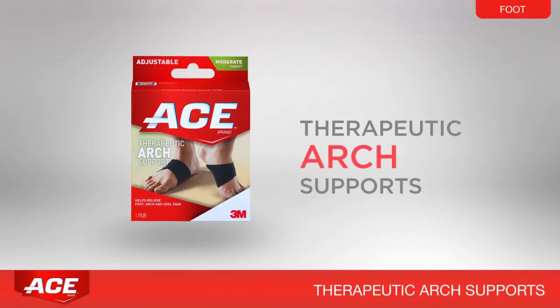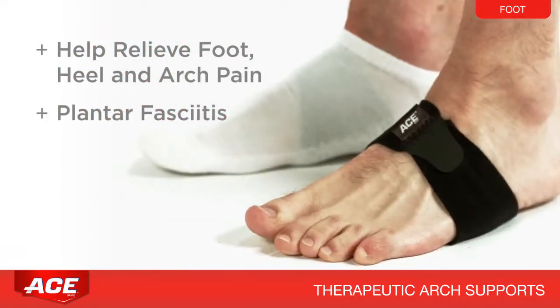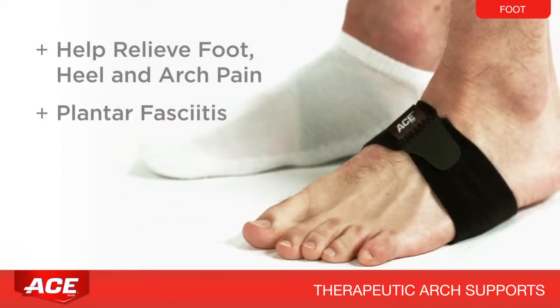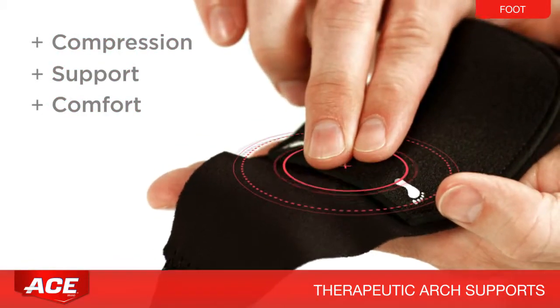Therapeutic arch supports help provide relief from foot, heel, or arch pain associated with plantar fasciitis. This unique system provides compression, support, and cushion comfort all in one product.